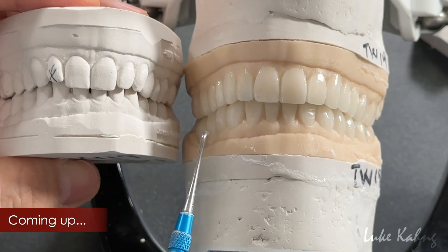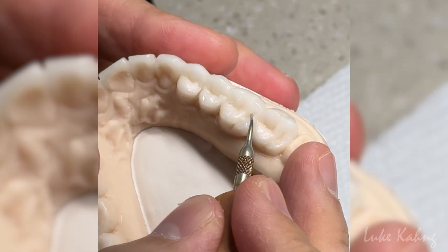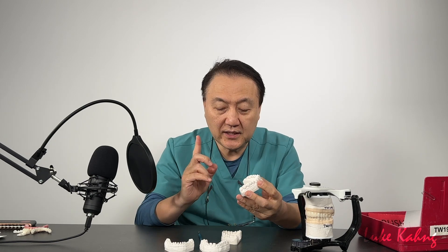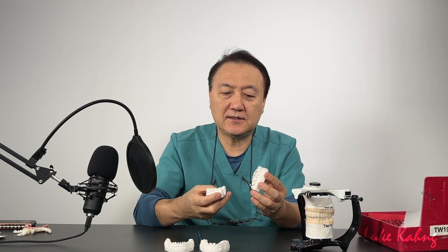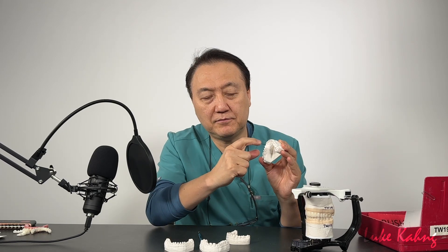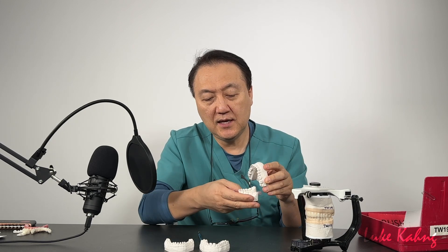It is very important regarding full-mouth rehabilitation cases before we go to the temporizations regarding 27-unit cases. First, what I do is evaluate the case — what is the crown, what are the veneers, what is the filling — and then I can diagnose. Someone built up the whole posterior and the patient's left side is too tall, creating interference. Also, the doctor will pull out teeth number 1 and number 16 — the wisdom teeth — and then I can build the case.